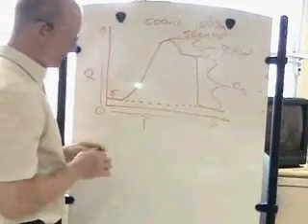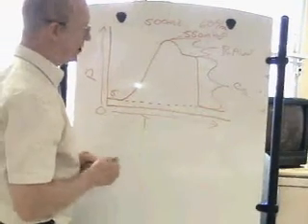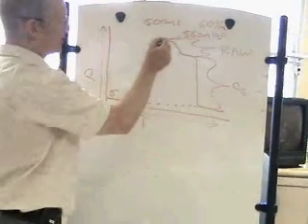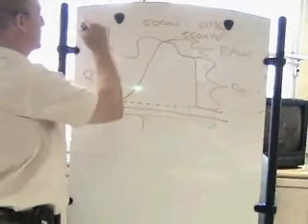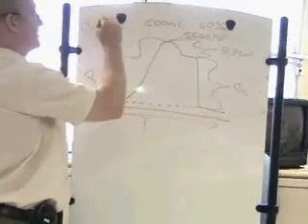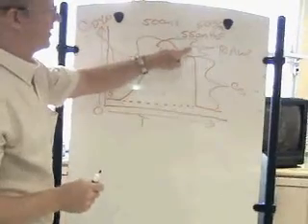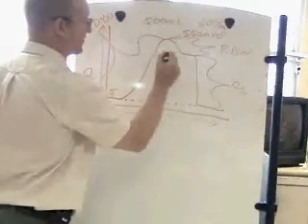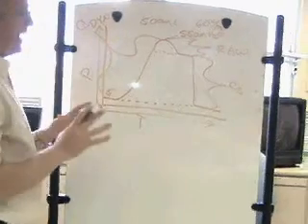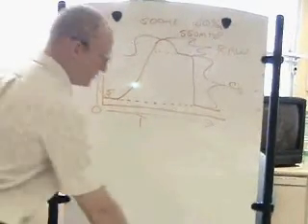So then the next thing that people start to ask is, well, why do we separate these 2 things out? Oh, and one more point just to bring it back to the previous slides. This obviously is the pressure used to overcome dynamic compliance. Okay, so obviously dynamic compliance is the sum of airway resistance and static compliance. So if we take a look at these 2 different levels and we start to explain why those pressures change, we get a better understanding on how to manage our patients.